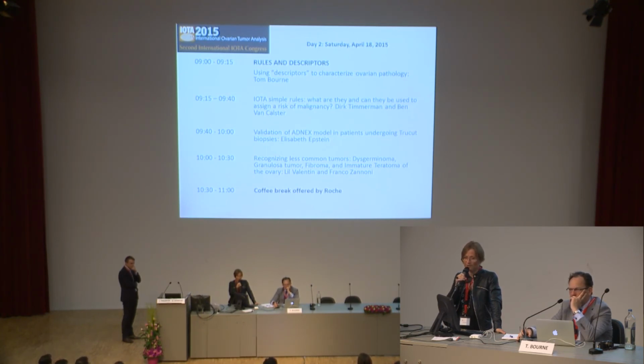I always try to get a good sample. Look, it's really important to scrutinize the pelvis and the abdominal cavity to see where you can most probably get the best solid tissue, and in a safe way, looking out for vessels and other things. In a purely cystic tumor, it's difficult to take a biopsy because you cannot only puncture the capsule, but if you see carcinosis and if you have solid components in the tumor, you should go for those areas. But as you can see, 3.5% were non-representative, and this was more like multilocular cystic tumors, a majority of those.